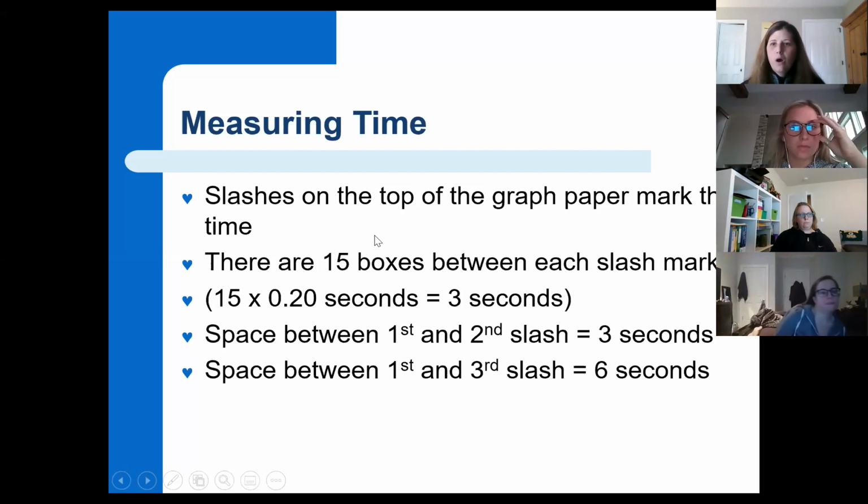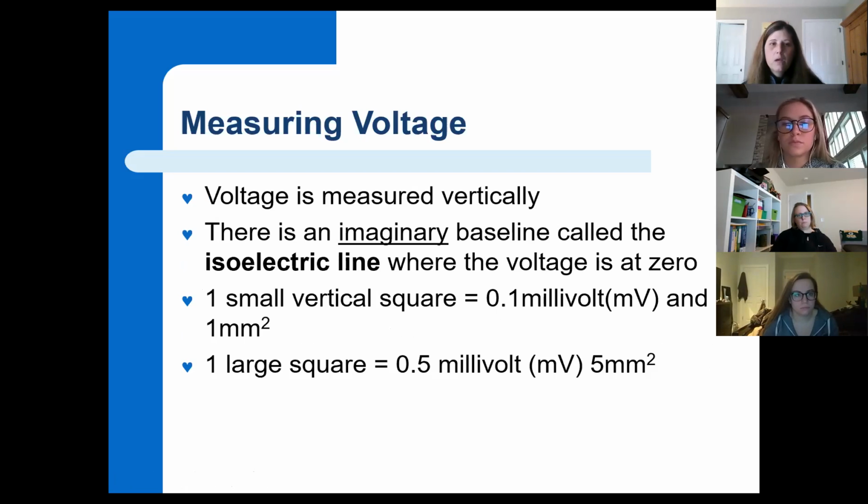I can't say always, but for testing purposes, it's going to be evident what we're asking you. Okay? It'll be evident. You're going to be able to figure that out. Now, I told you a minute ago we're going to talk about voltage.